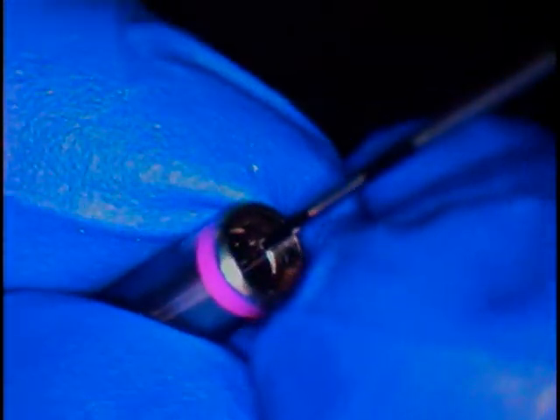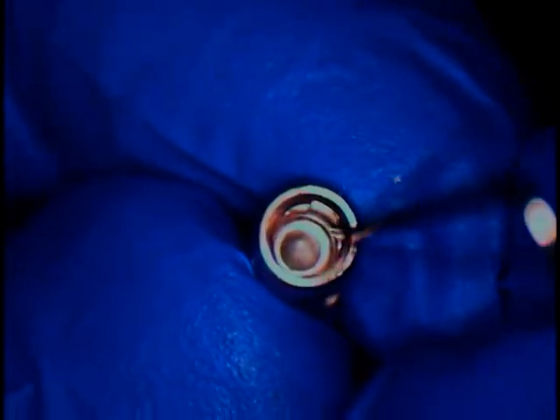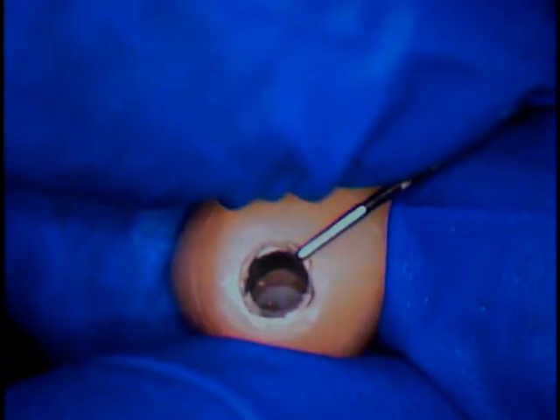I'm going to pull out a replica of the implant — just a used replica, not to be used in the patient's mouth. So if I were to measure in millimeters, this is exactly the same depth I'm going to have — close to 5, maybe 4 millimeters in depth. Inside you'll see that there are four little key indexes. Right now we just don't know which index goes where because the internal aspect of the tie base is round, so we'll select one. As far as thickness is concerned, you're dealing with maybe a tenth to two-tenths of a millimeter in thickness. Not much at all.